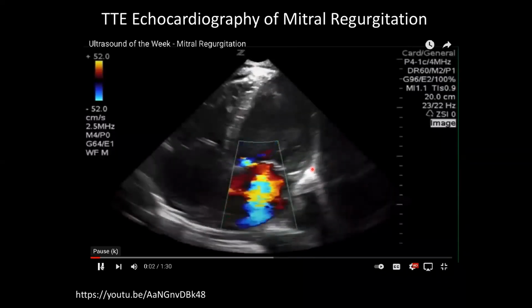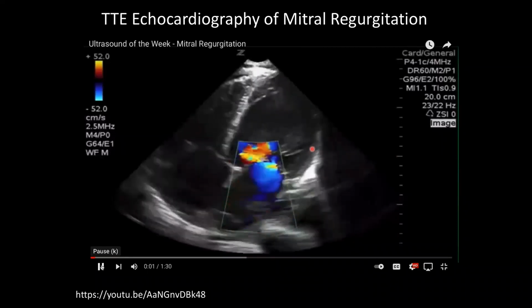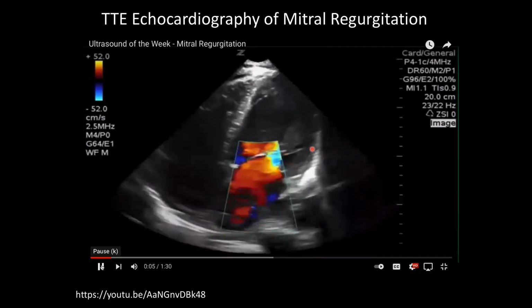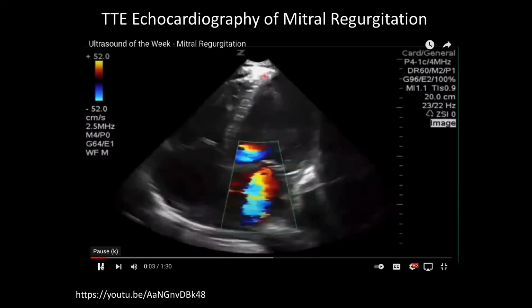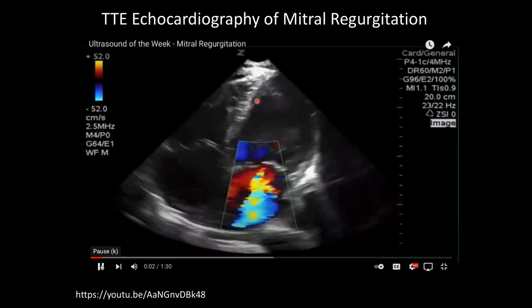So here's, we've seen this a bunch of times now, but if you look at this left ventricle and you had experience, you would say, this left ventricle is in bad shape, okay? Because one, the septum is really thin compared to the total dimension of the ventricle itself. So it's become a thin-walled, large object.